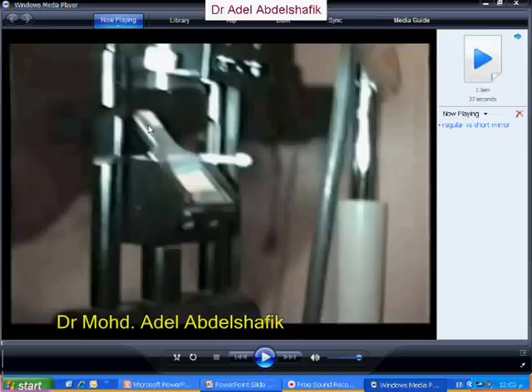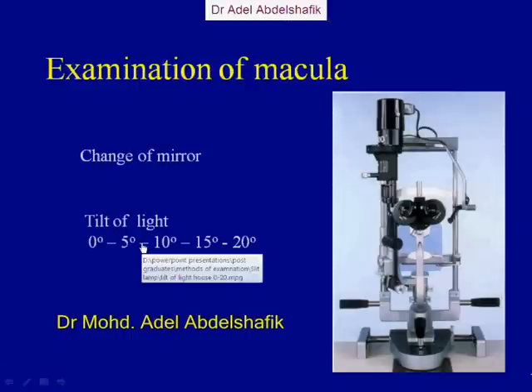The long mirror, this part, if the light and the microscope are coaxial, will prevent me from seeing. But if I remove this part and get just this short mirror, I can have the microscope and the light coaxial, and I can see through. This is just the idea of this short mirror. Now we need to make a tilt. We can understand tilt from the sides. If you have a vertical slit, you can get the beam from the side at 5 degrees, 10 degrees, and so on. But if it's horizontal, how do we make this tilt?